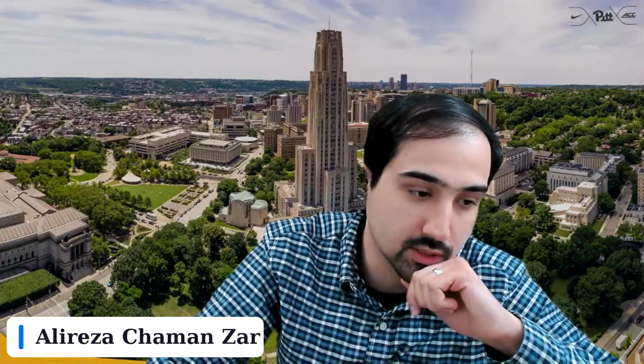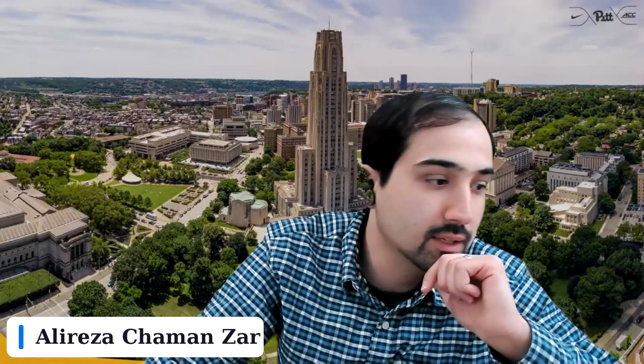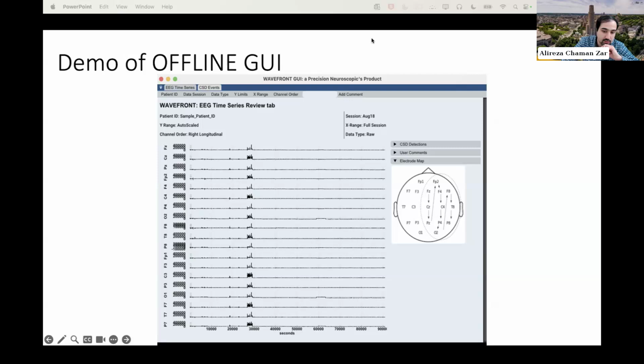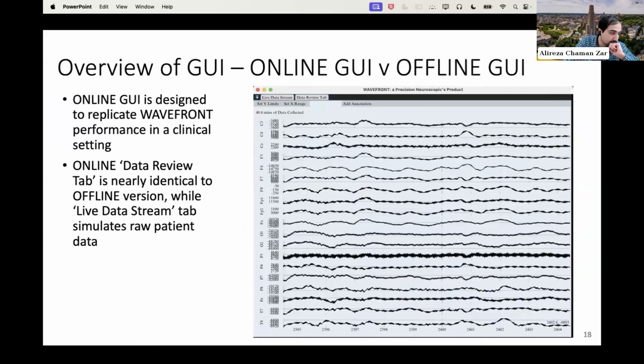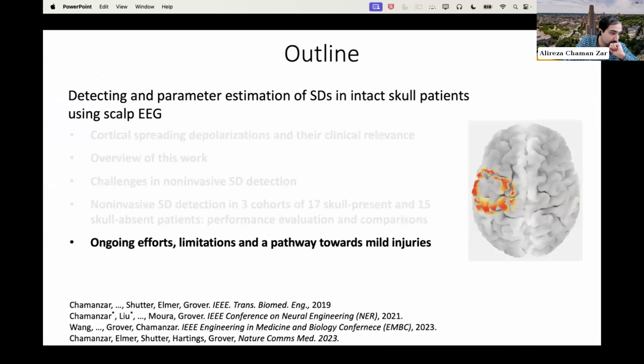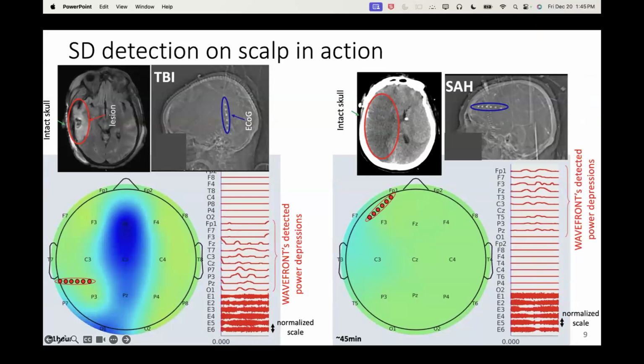And for some of the actual real patients that I presented in the 2 videos, for TBI and subarachnoid hemorrhage, we do see those tiny bumps. I can actually maybe project again. They are also happening at the same time and at the same kind of space where we have the ground truths for SD, but these are preliminary. So we need more data, better training process, but these are the things that show up after the pre-processing. Yeah, if that makes sense. Wow, that's incredible to see.